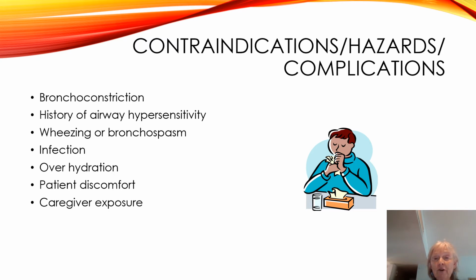Patient discomfort, excuse me. Patient discomfort can be because of the bronchoconstriction, the bronchospasm, the fact that the patient is not comfortable with this, that we've increased their work of breathing and their airway resistance. So we have to watch that also.